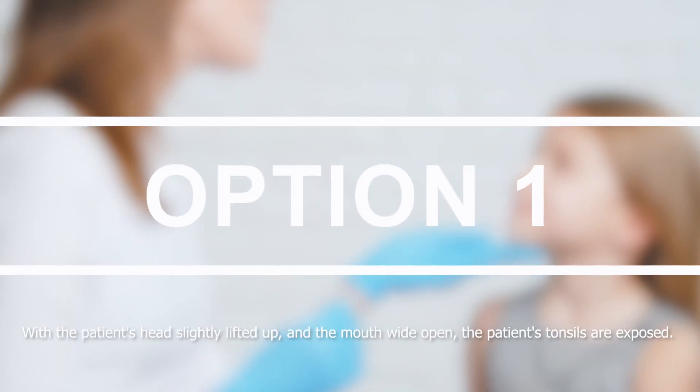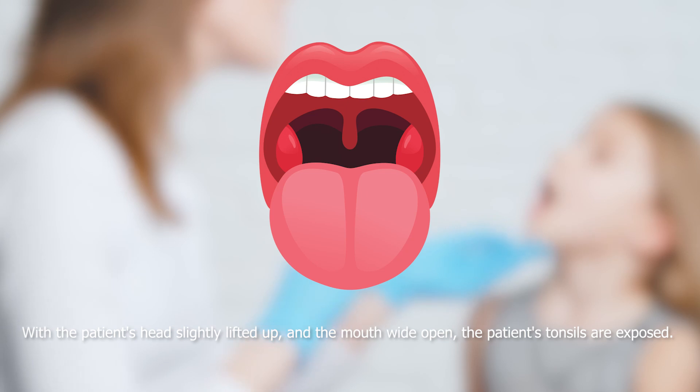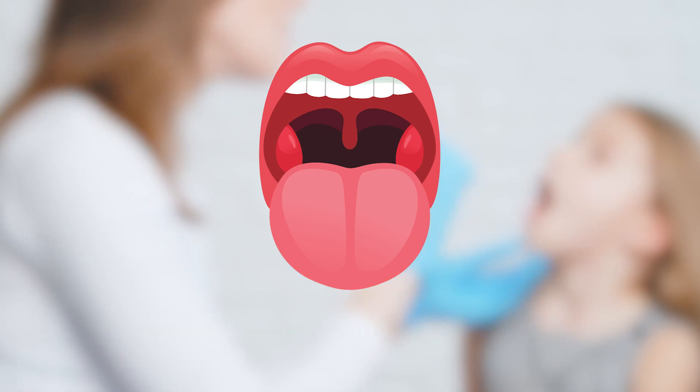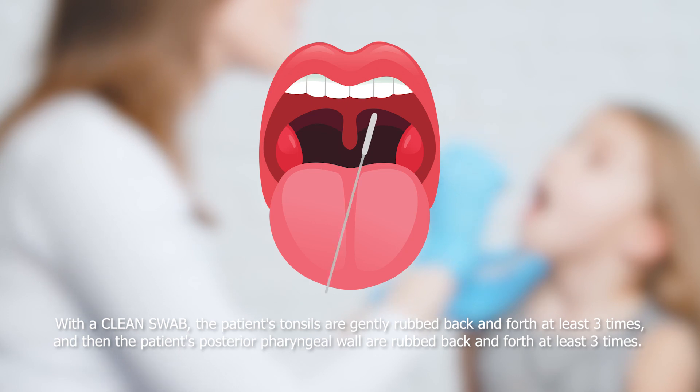With the patient's head slightly lifted up and the mouth wide open, the patient's tonsils are exposed. With a clean swab, gently rub the patient's tonsils back and forth at least three times, then rub the patient's posterior pharyngeal wall back and forth at least three times.